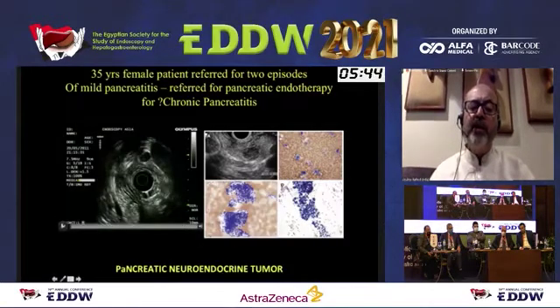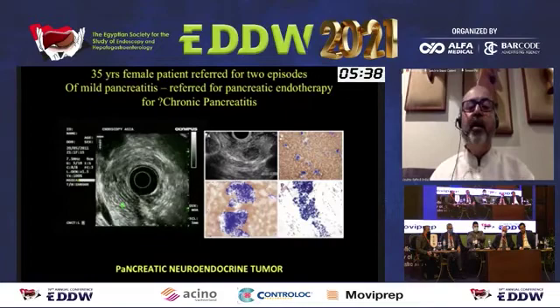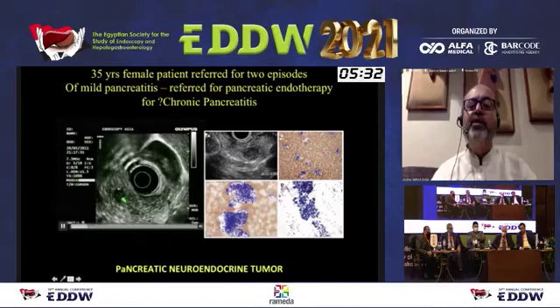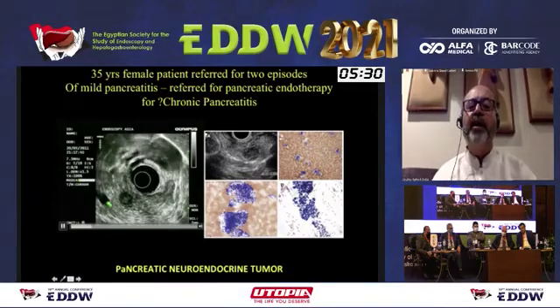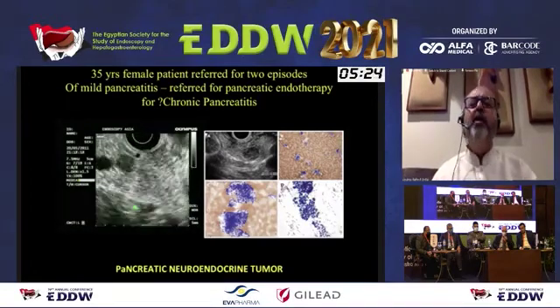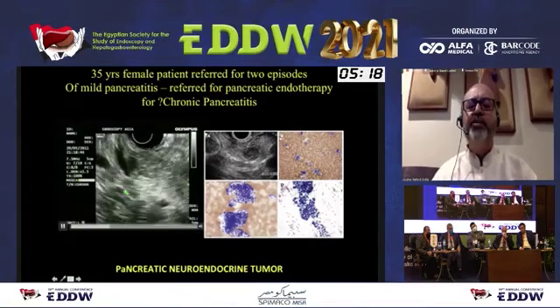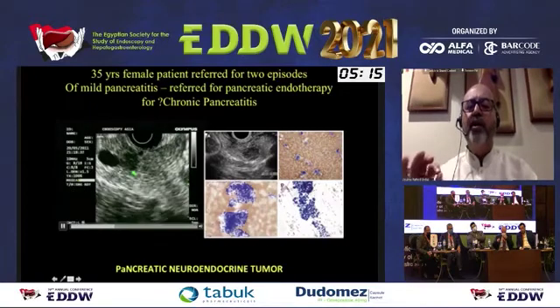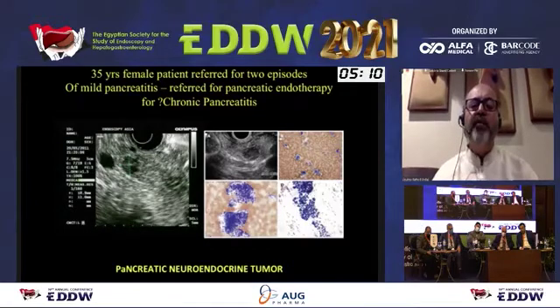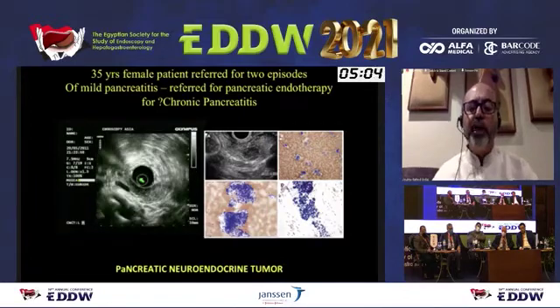So this is something which we need to understand. I'm going to skip that, but these are the cases. Say for instance, this was a case in 2011 where we did not have contrast enhanced EUS, but I would have definitely not done an EUS FNA for a beautiful looking tumor in the pancreatic head genu region. This is a classical neuroendocrine tumor, which you don't need an FNA for, but the surgeon insisted that I need to have a tissue diagnosis. And you can actually see the pancreatic duct is getting compressed here, leading to pancreatitis because of a tumor. So this kind of small lesions we can pick up very, very well, which is around 1 centimeter. And then you can even target them and take a proper tissue diagnosis.